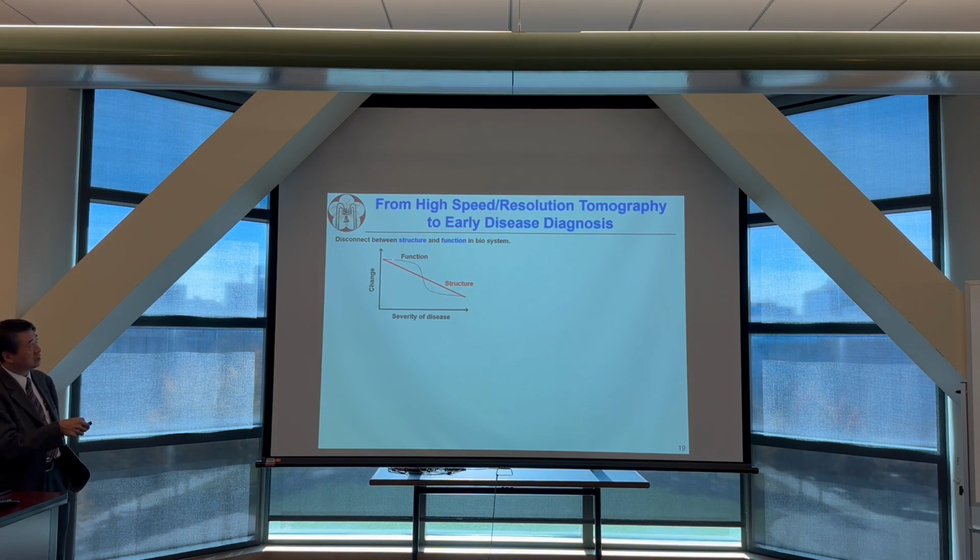So even for the function, it seems like still something working well, but structurally speaking, it starts to change. So OCT has high chance to do things in the early stage.